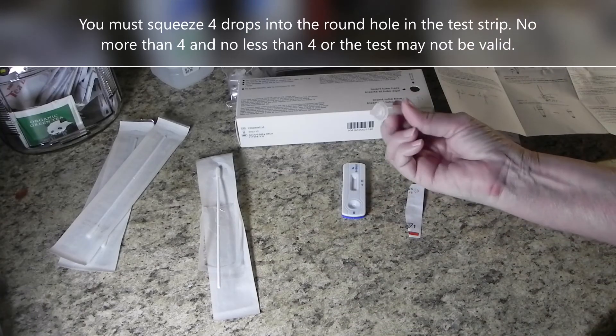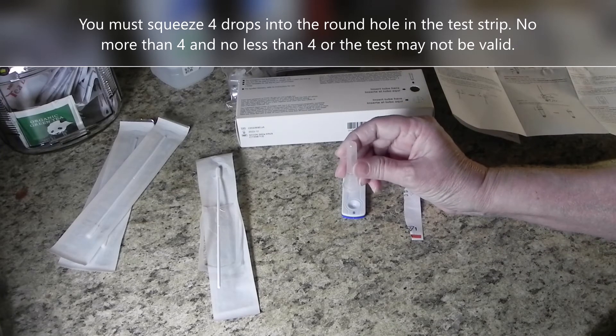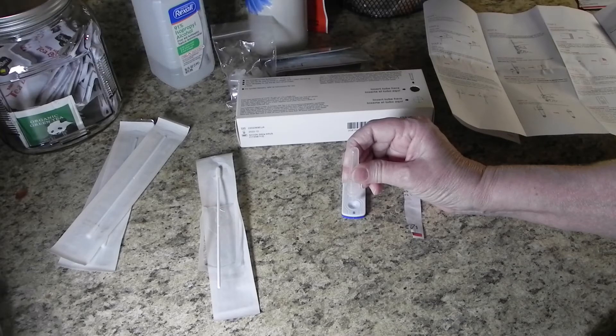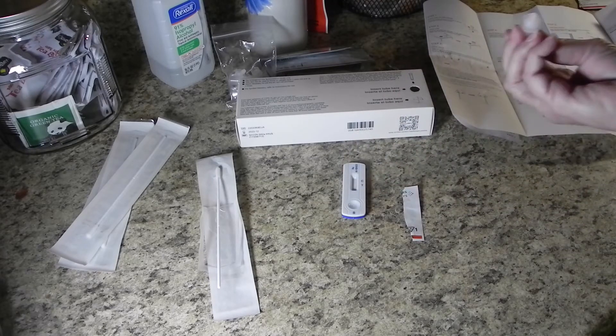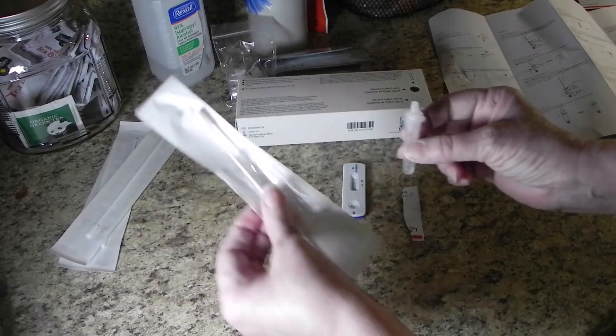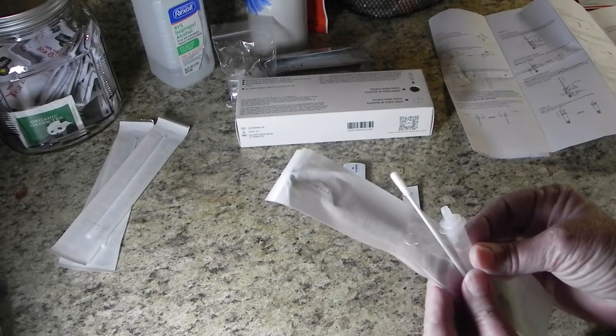Turn the tube upside down and carefully count the drops as you squeeze: one, two, three, four. The tube and Q-tip can be thrown away now.